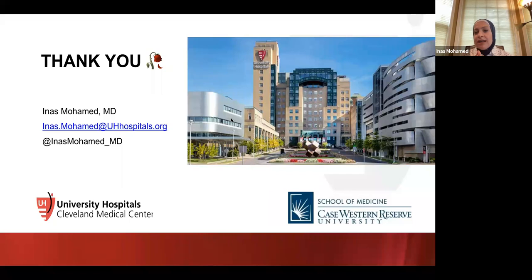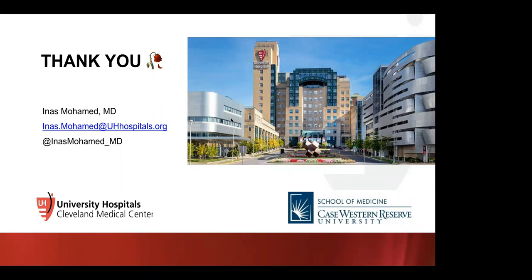Even if a patient, let's say a patient with breast cancer, has lesions in the liver on CT, we send her for MRI and we interrogate each lesion separately. This can be a cyst, but next to it is a metastasis, right? So yes, each lesion has to be interrogated separately in the MRI of the liver. Thanks a lot, doctor. Thank you. Thanks.